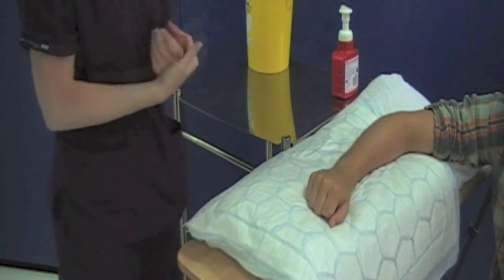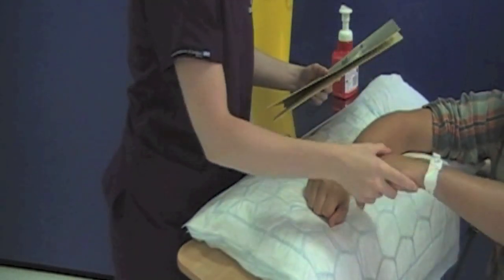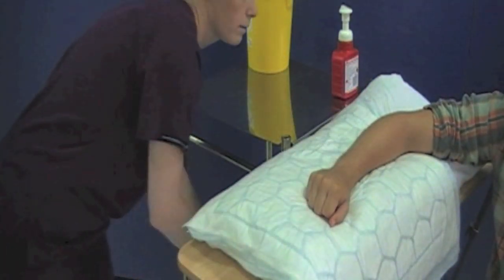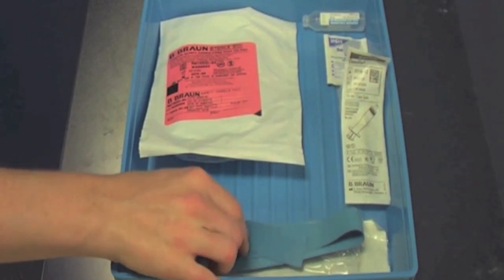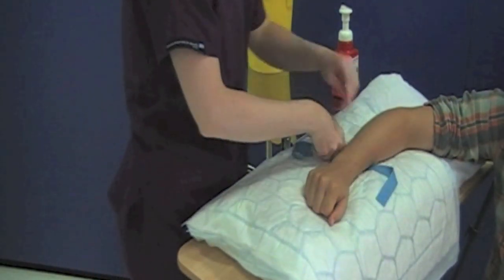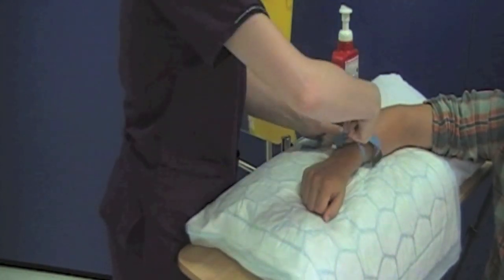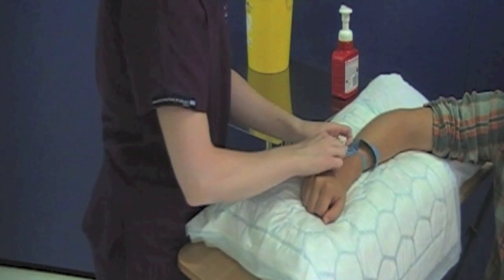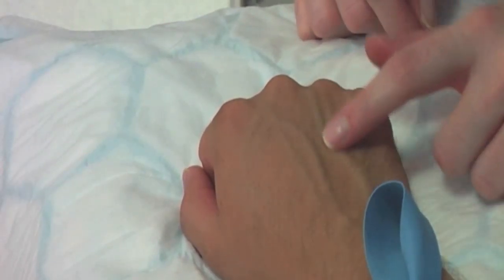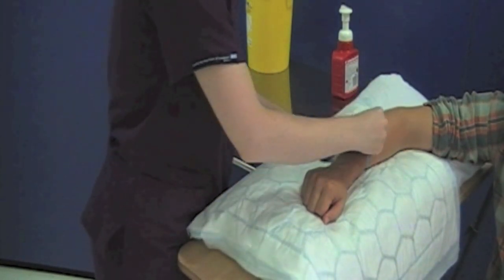You should reconfirm the patient's identity against an official hospital document and confirm that the patient is happy for you to proceed. Position the patient so that they are comfortable and apply a disposable tourniquet to help locate a vein. It is good practice to initially attempt to cannulate the back of the patient's hand and work up towards the antecubital fossa if there is no suitable vein. Once you have located the vein, release the tourniquet until just before you perform the procedure.